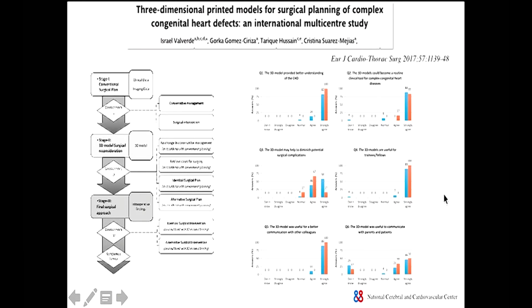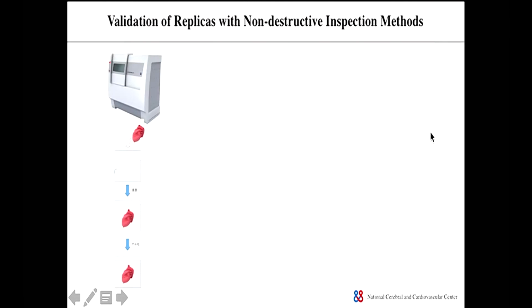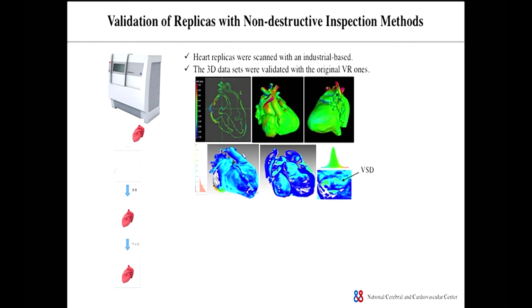So a similar discussion, a similar paper, has also been published by the European group. Those 3D models are highly evaluated by surgeons and pediatric cardiologists. And another very important point is the validation of the replicas which we made. So we evaluated this model by using industrial-based 3D CT, a kind of non-destructive inspection method.